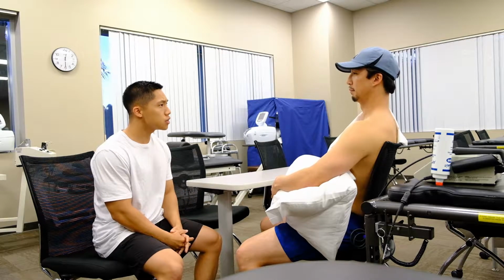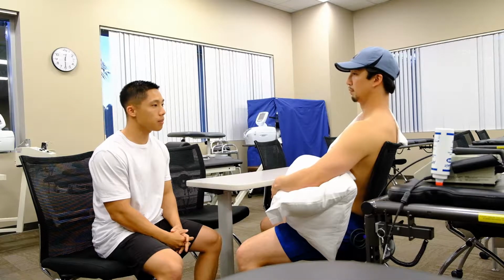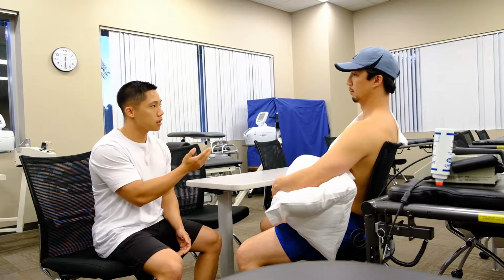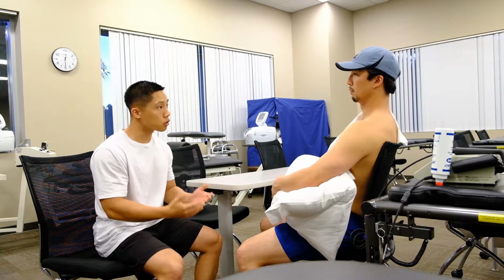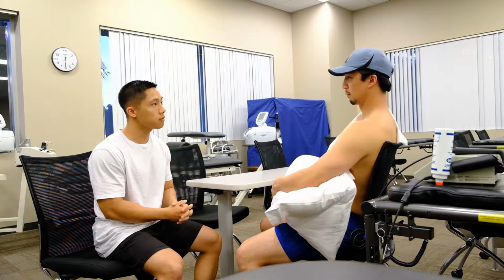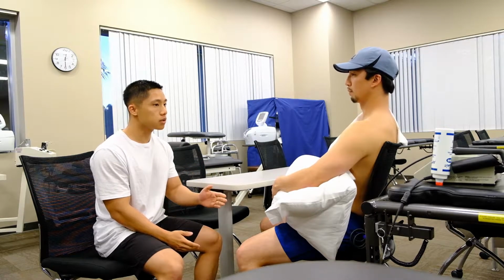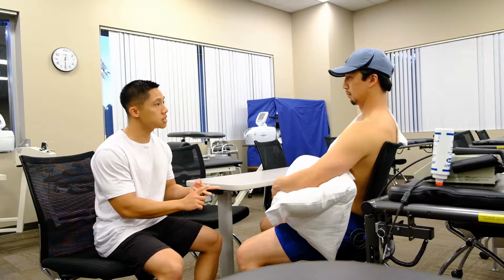Good. Okay, so I understand you're coming in for some trapezius pain right up here. So I wanted to use a modality called ultrasound to go ahead and kind of address that situation. But before we continue, can you please tell me your name, today's date, why you're here, and where you are?